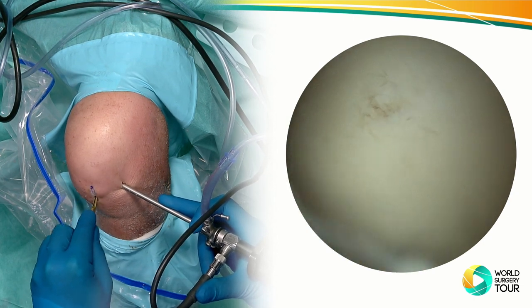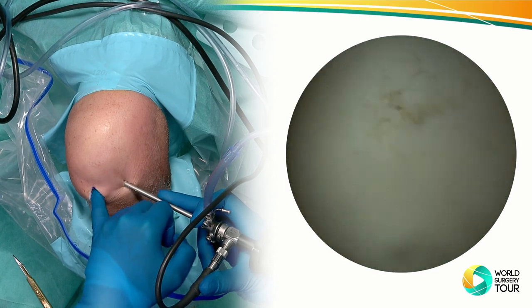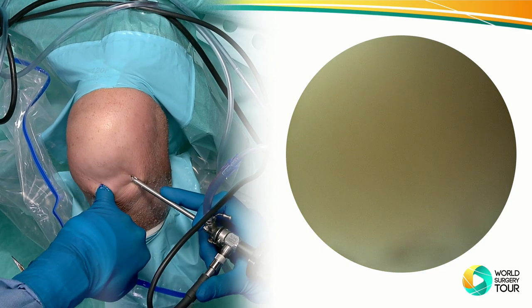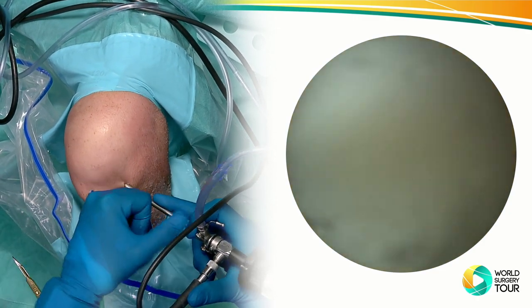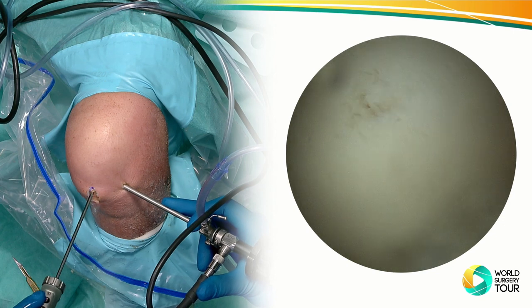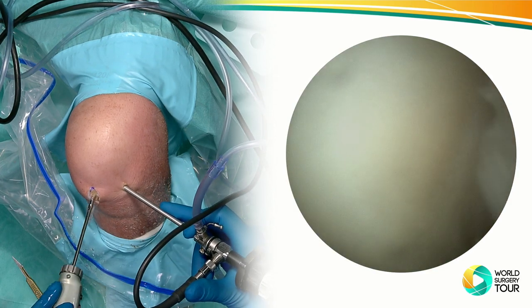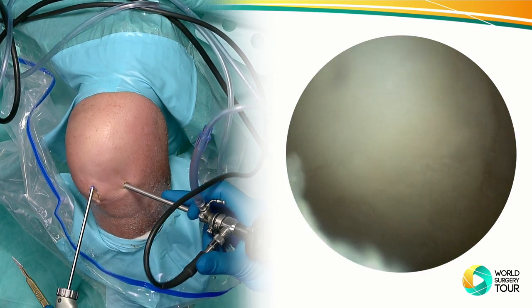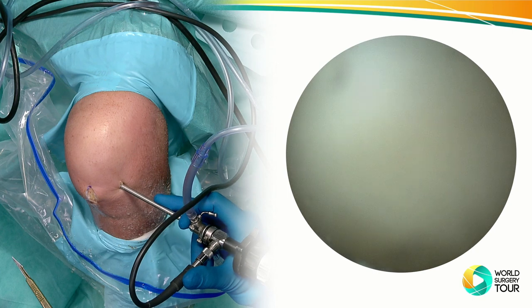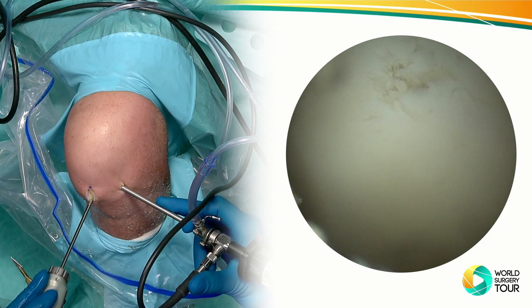I always like to see my finger passing through that portal, so this pinky ideally, so that I know that I have easy access to the tissue. As you can see here, when I do that, sometimes there's little fatty tissue in your way, so just take your time. If you feel that you cannot see it, you're going to see my finger in a second. You take a shaver. I will strongly advise you to take that time to really remove a little bit the fat tissue right next to your portal, because otherwise you're going to see it coming at you all the time, and it would prevent you from having an easy access of the cannula. Let me put this in.